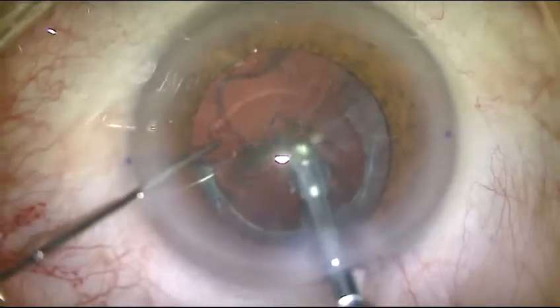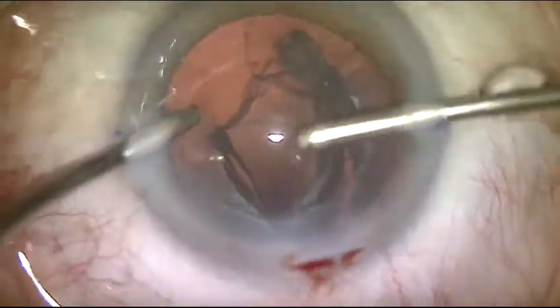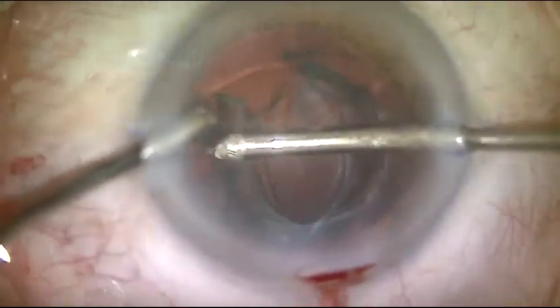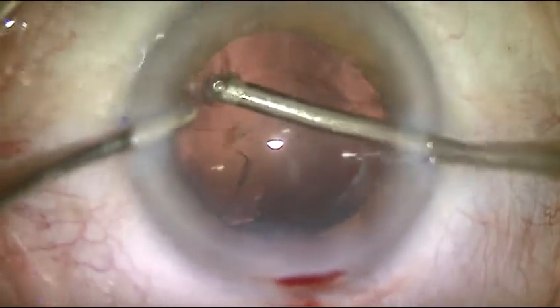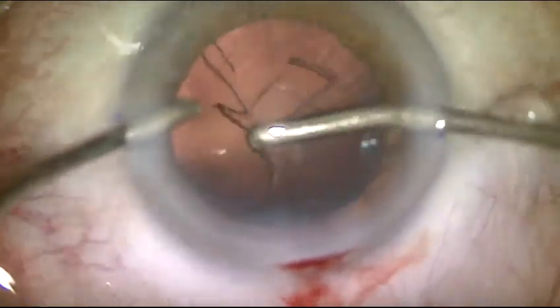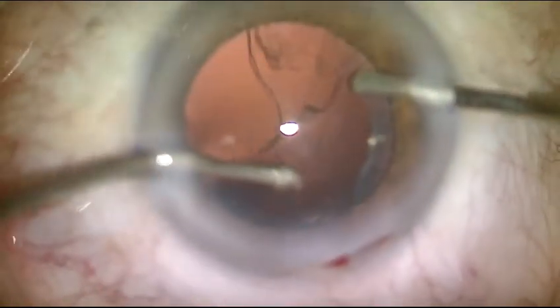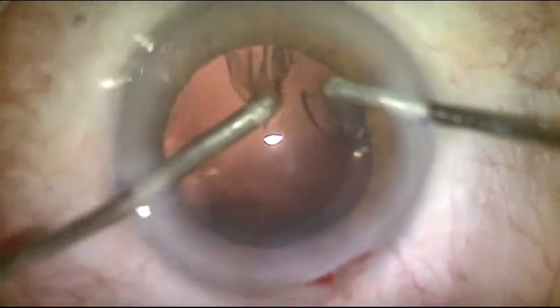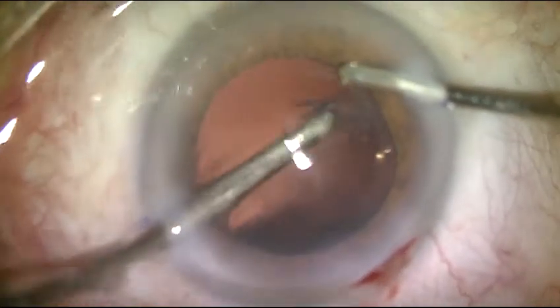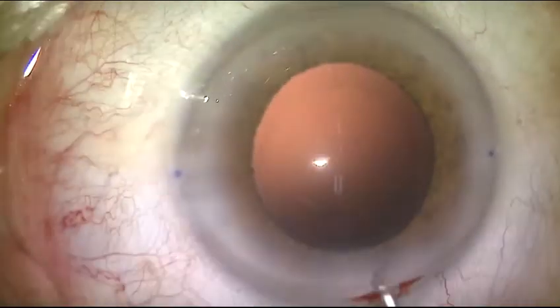The lens can be aspirated without the use of phaco power. The other half of the cortex can also be aspirated. Viscoelastic.